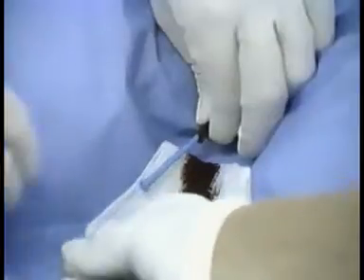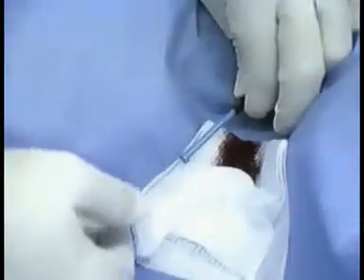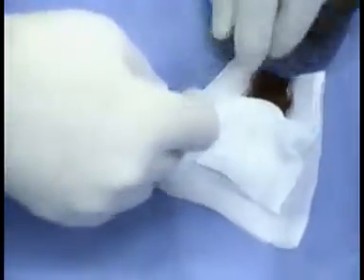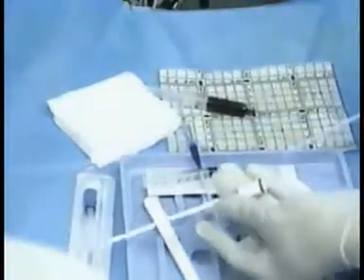Take off the syringe and advance the guide wire through the introducer needle. Never let the whole guide wire enter the patient. Once the guide wire is in, the introducer needle is removed, leaving the guide wire in place. Next, make a small nick in the skin with a scalpel at the entry point of the guide wire.